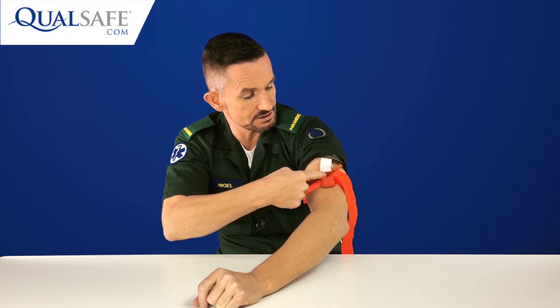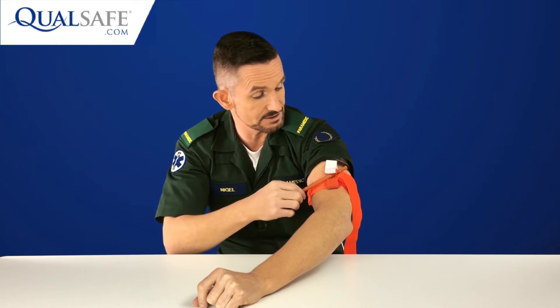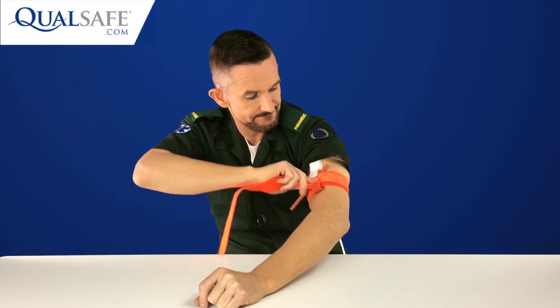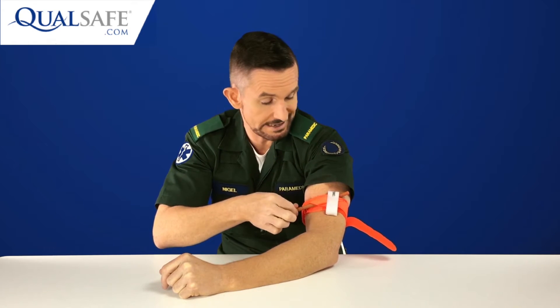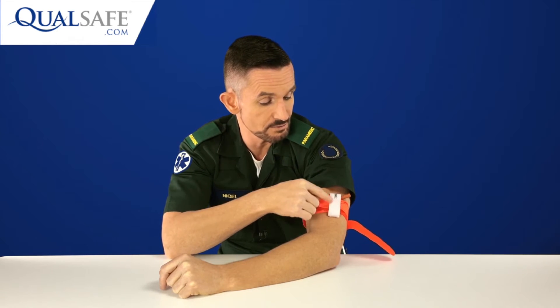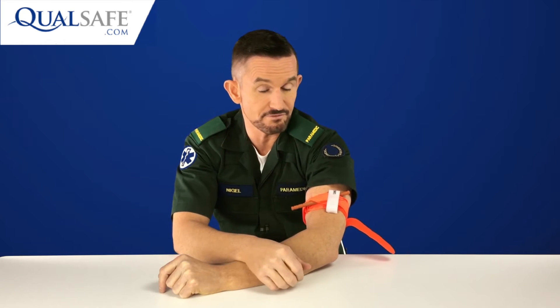Once twisted tight enough, the windlass hooks into this C-cup shape, which is really easy to do, and you can twist it tighter if needed. Then you wrap the white velcro strap over to stop it popping back out. The tourniquet has a section marked 'time' where you write the time it was applied — that's really important because the doctors at hospital need to know exactly how long the tourniquet has been on. It stands out clearly right on the front.